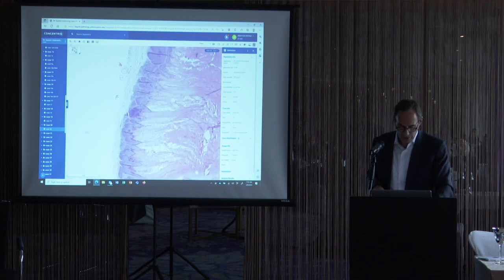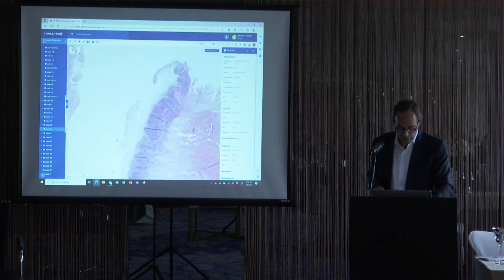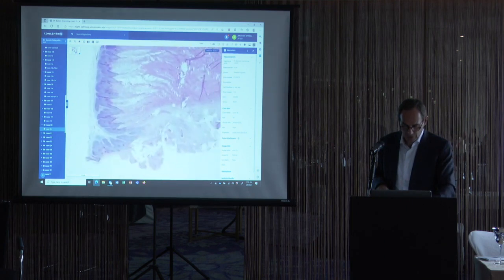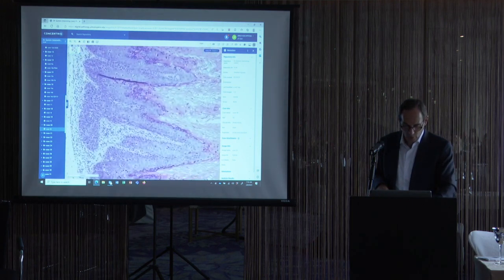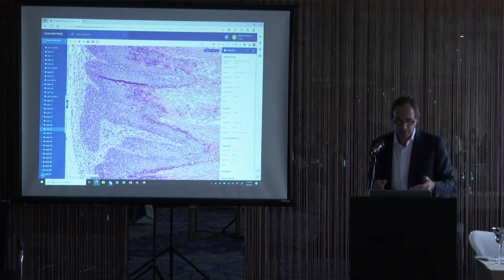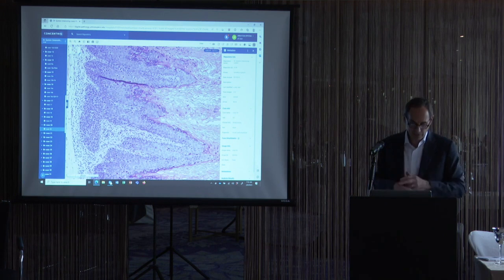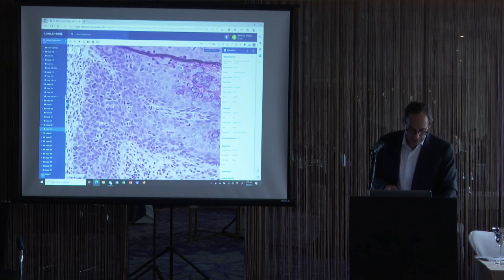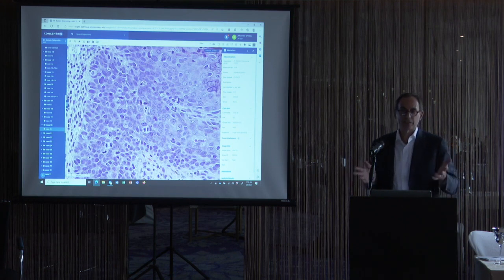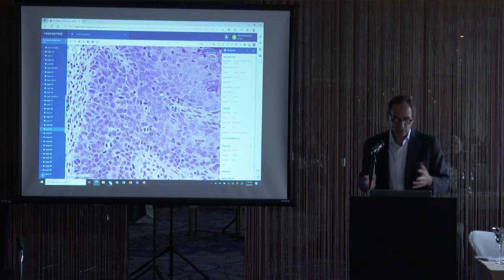The basaloid carcinoma component is that it looks very blue. These are the kinds of cancers that are very HPV associated, basaloid and warty. Usual squamous cancer is only HPV related about 50% of the time. Verrucous cancer, despite its name, is never HPV related. But here, when we see this very basaloid proliferation, just like in the anus or the cervix, that's classic for a basaloid squamous carcinoma component.